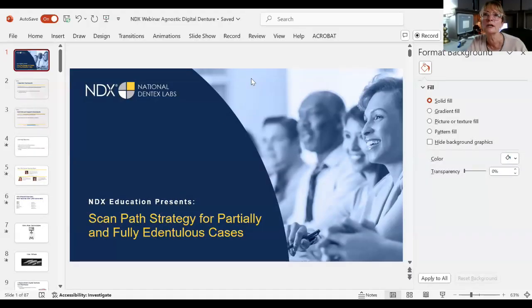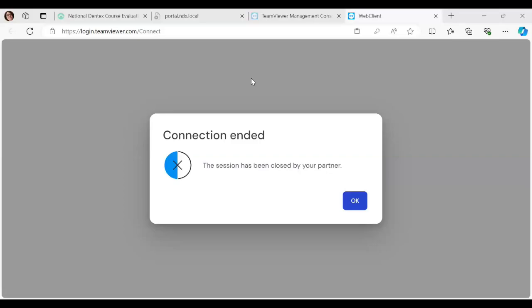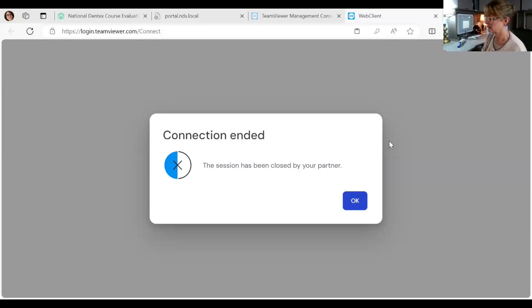And I'm going to stop my share. Okay. Let me check my chat and then I'm going to go to the Trios. Was there another question? Or is that you, Jessica? No, there wasn't. It's just me right now. Okay. It'll flash one more time. I'm just pulling up the last one to attach. Awesome. Thank you so much for doing that. Absolutely. Oh, shoot. I connected before we started and it timed out. So bear with me one second.